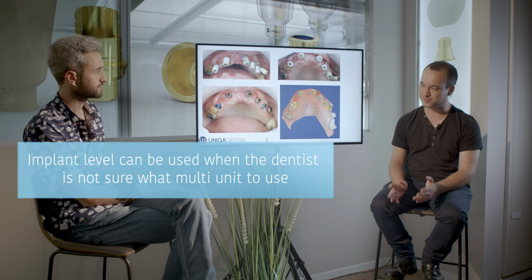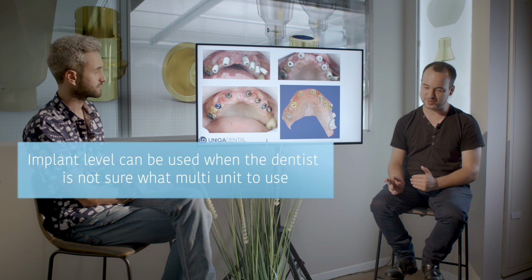If you use implant-level scan abutment, on the one hand it's great because you can choose from all of the options, all types of multi-units. You can choose all the straight ones, all the angulated ones, and change between them. But here, the most crucial part is how you transfer this information from the technician back to the doctor, because sometimes the technician doesn't tell the doctor exactly what type of multi-unit he used.